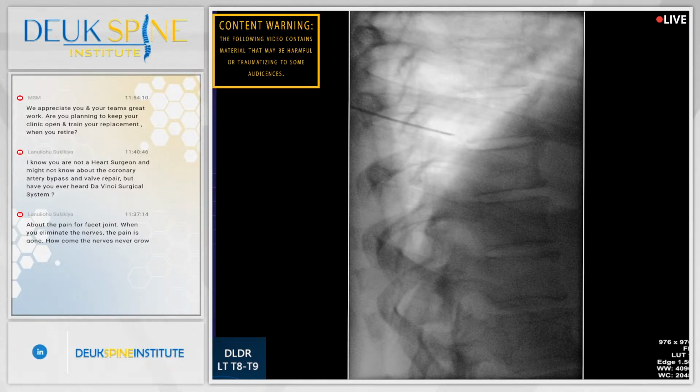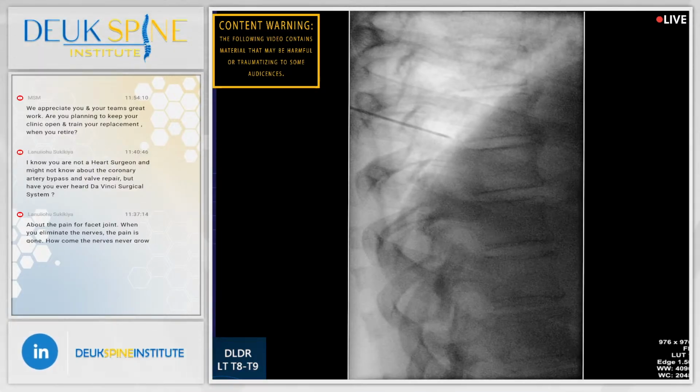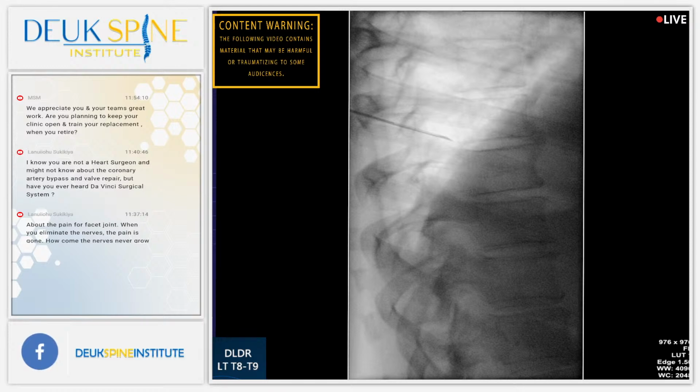It's just constant bone. There's just no give. There's no passage. I mean, if anything, that looks the best we've had it. But I'm still not entirely happy with it. AP.